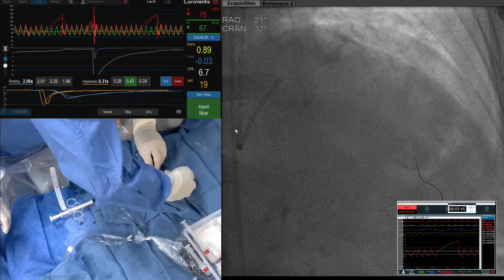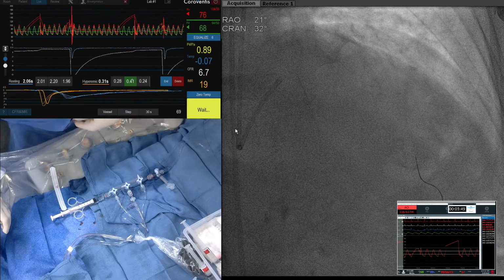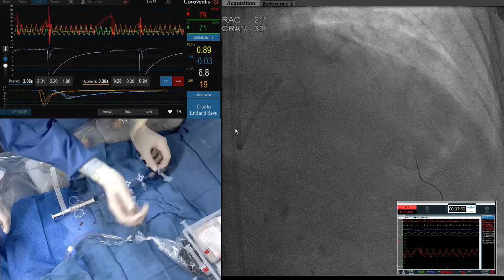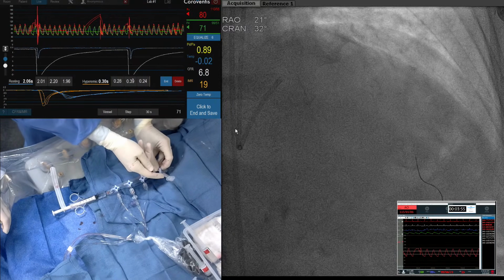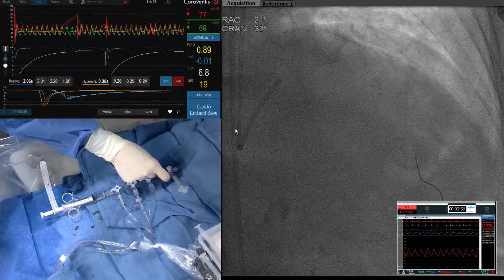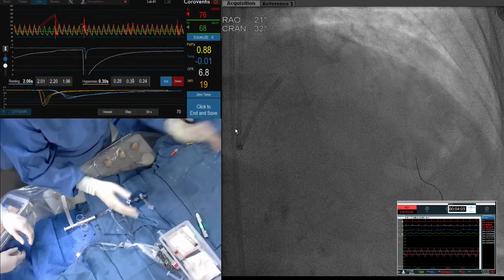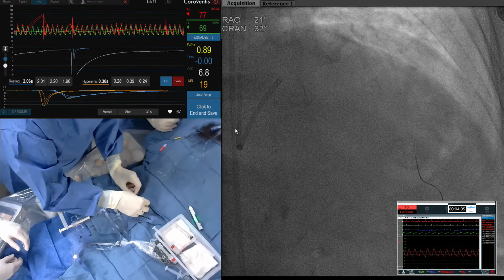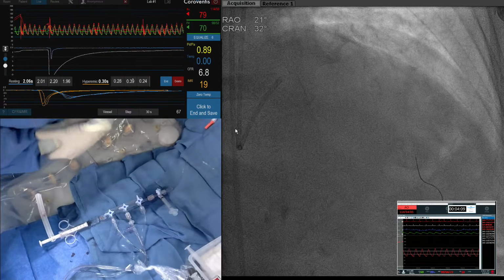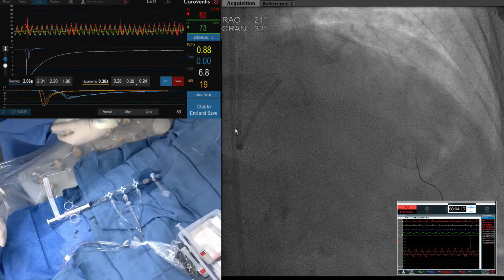So do you inject the 3 cc's quickly, slowly? What's your technique? As quick as I can. We use a 3 cc syringe here. We were doing it up at the guide, but it was very awkward for our hands, and we got used to it here. Again, it's just displacement. Up here, I put my palm on it and inject very quickly, much faster than a cardiac output, and close the tubing well so you don't get air.